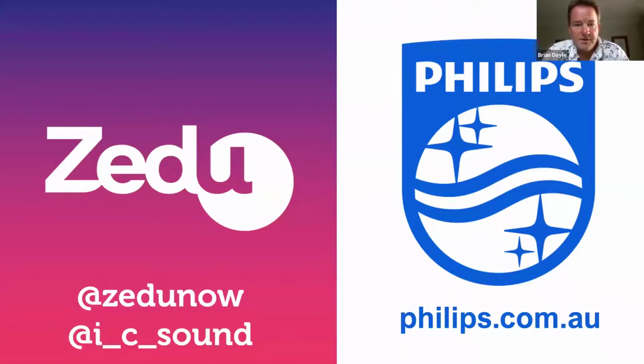So, Anna, I think that's been a really great overview of the RUSH exam. One thing I would comment on is that very often we do have some history to help guide us right off the bat. And we generally, even before we pick up the probe, have some clinical suspicion as to what we think might be the cause of shock. And I think a lot of us in practice will cater our first look at what we think is the most likely. So if you think it's a ruptured ectopic, you're going to look into the pelvis. If you think it's cardiogenic shock, you'll probably look at the heart. If you think it's tamponade, you'll look at the heart. Ruptured AAA, look at, obviously, the aorta. If you're not sure, I don't know.